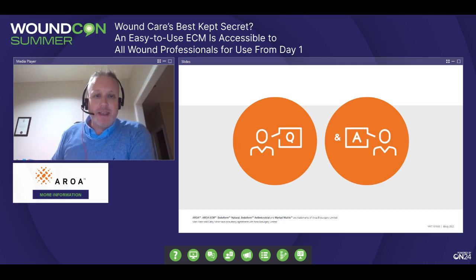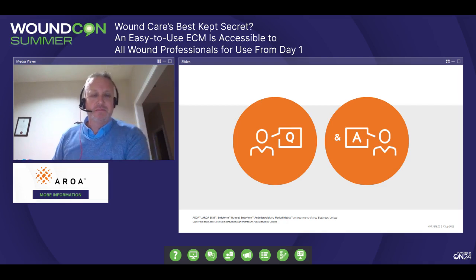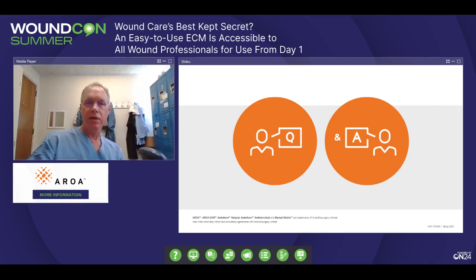Dr. Malene, occasionally I've got questions from patients about religious or cultural acceptance for products I'm using. Any concerns here? Well, I think the first thing to do is just be open and transparent. It's sourced from a sheep. If within their faith there is a concern about a sheep-based product, then I think we have to be incredibly respectful of that, and I would always err on the side of caution when it comes to discussions of faith.